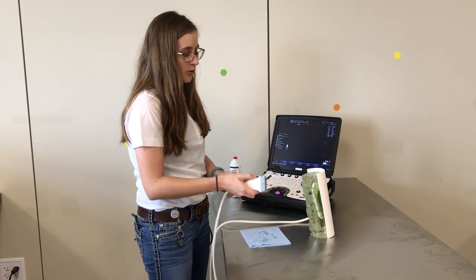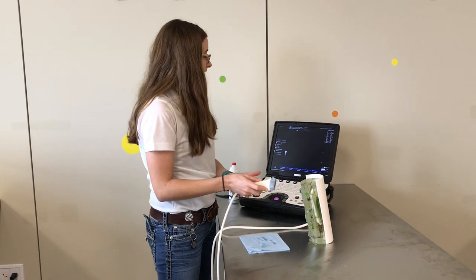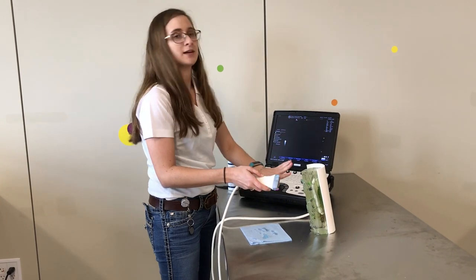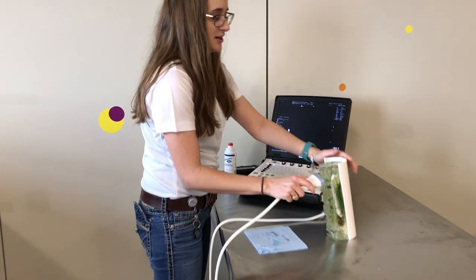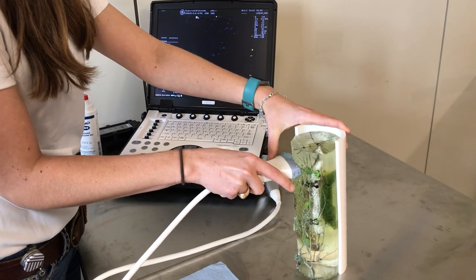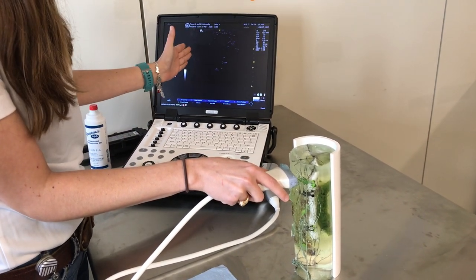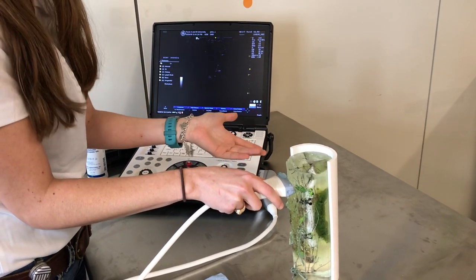Now that our limb is ready, we want to make sure that we know how our image is going to be oriented. Knowing that the notch on the probe matches the logo on the screen, I like to make sure that the screen matches what I'm looking at on the limb. So let's say this is the left limb of the horse. If I put my probe on the limb, I'm going to put my notch to match this side of the screen. So my notch is to my left, which is the left side of the screen — that makes it easier.